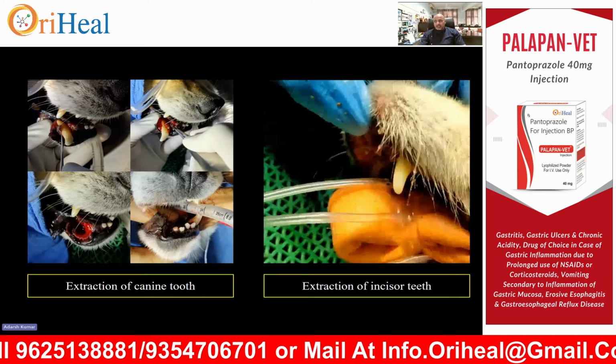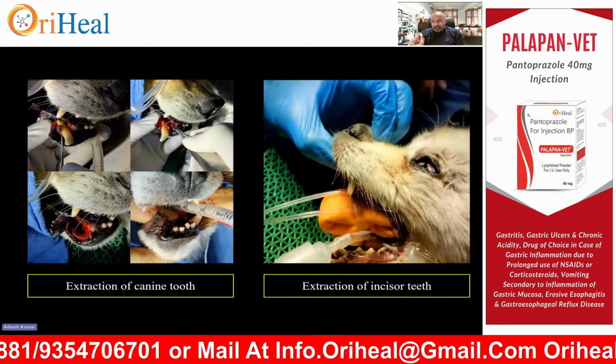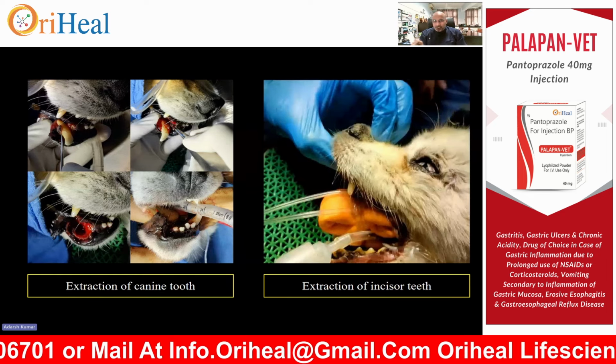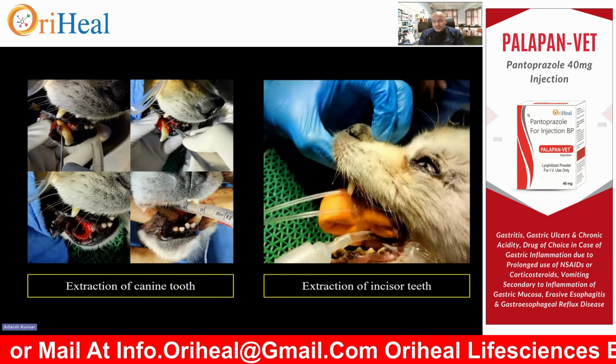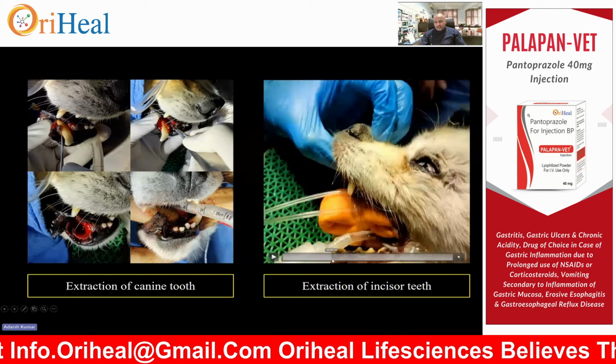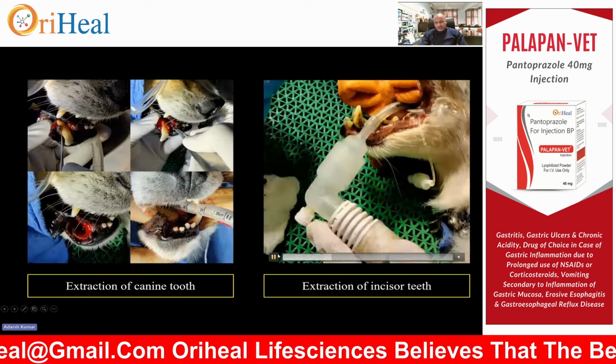Please note, some of my videos are in time lapse motion, just to tell you. So don't shake the way the video is depicting the hand. They are time lapse motion just to cover the events in the video, but don't shake it like this. Okay. So it is very fast, but you have to be very, very gentle here.